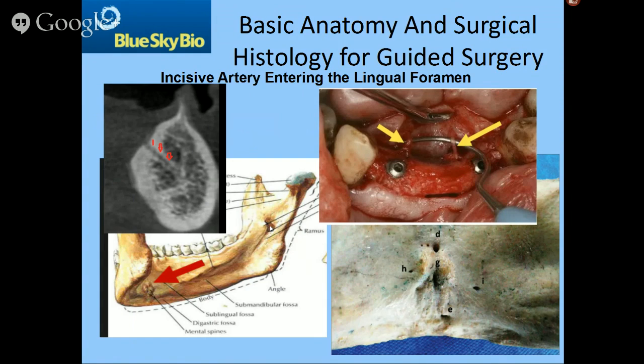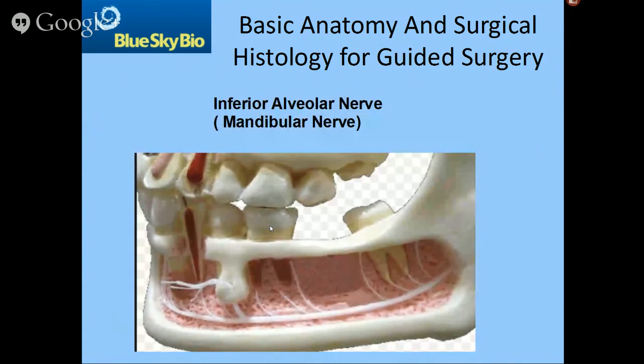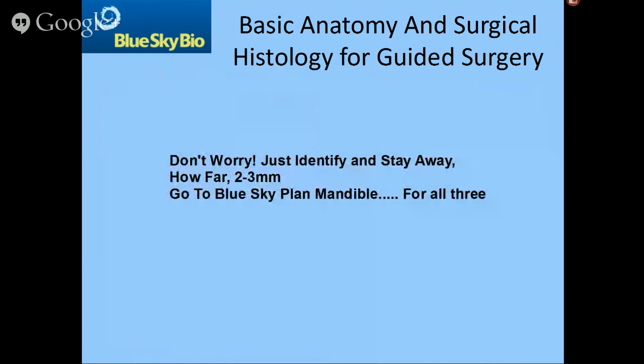So let's do this. Let's talk about the alveolar nerve for a moment, and talk about safe distances and so on and so forth. I just want to run through a couple of slides myself to see where I am.